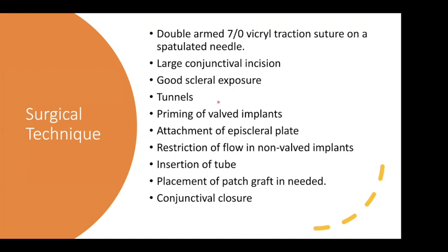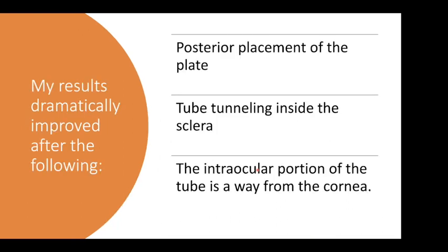I'm using tunnels, the priming, the fixation with non-absorbable sutures. You can use 8-0 or 9-0 nylon. I'm using Ethibond. And then restriction of the flow in non-valved implants is not common actually here in Egypt. Insertion of the tube.